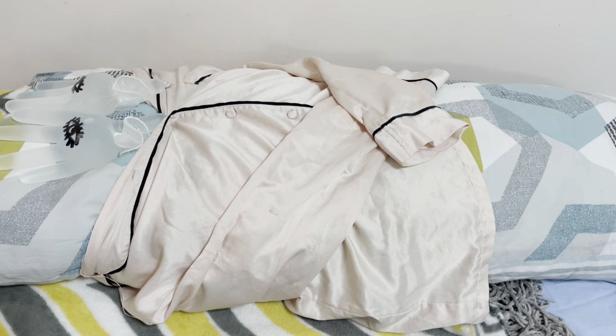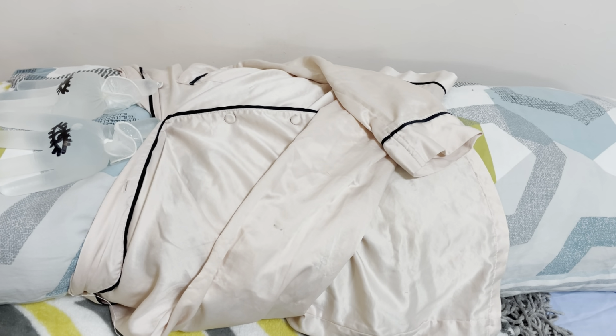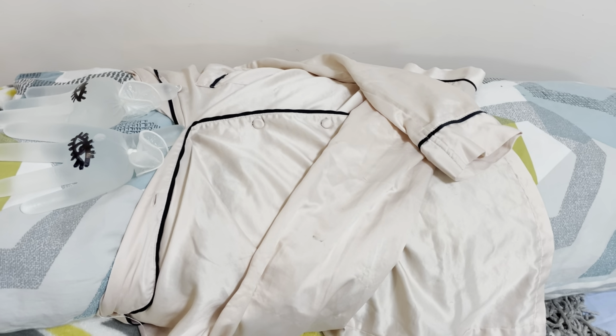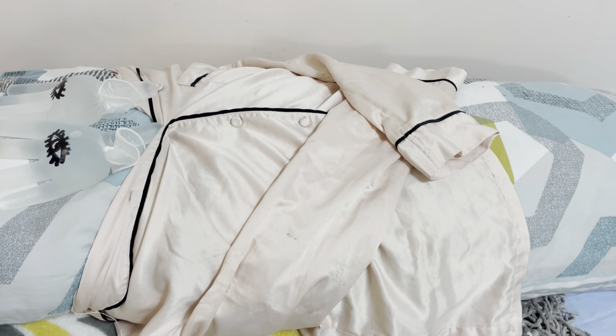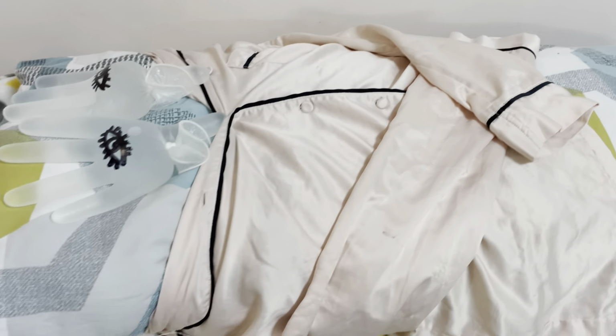So here we have Mrs. Suarez. We position her in a supine position with the head tilted to the side of the infected eye. Her infected eye is the right side, so we're going to tilt it that way. Now the reason for that is to prevent the solution from spilling.